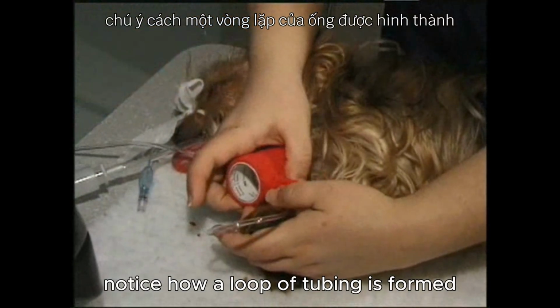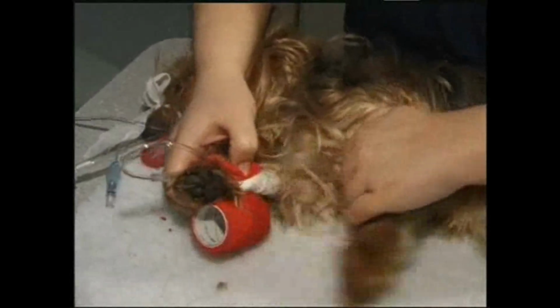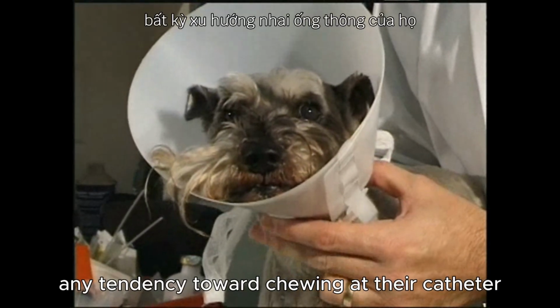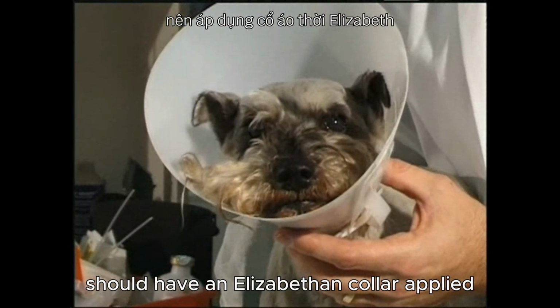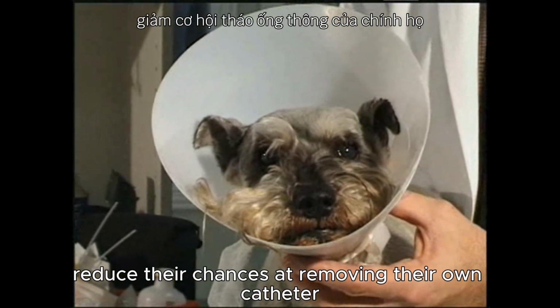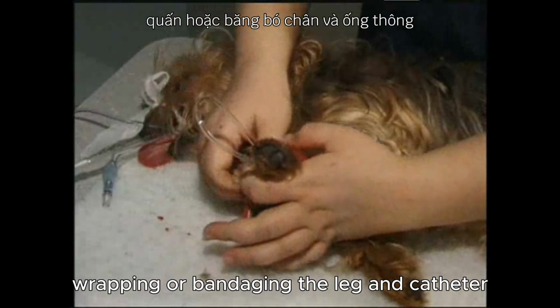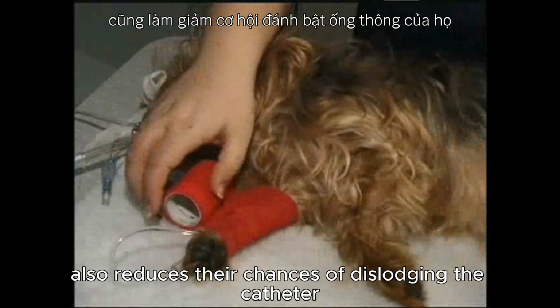Notice how a loop of tubing is formed so as to minimize the direct pulling out of the catheter. Animals that show any tendency toward chewing at their catheter should have an Elizabethan collar applied. This will dramatically reduce their chances at removing their own catheter. Wrapping or bandaging the leg and catheter also reduces their chances of dislodging the catheter.